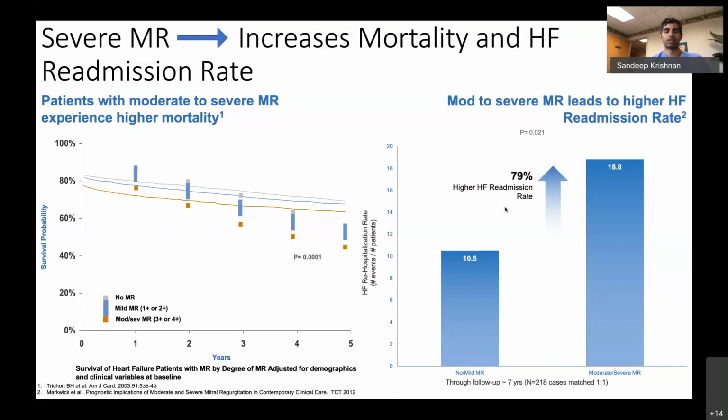Sometimes you can have a very, very severe patient with a very large amount of mitral regurgitation. But the problem is we miss it. Because we miss the jet, we're a little bit off axis, and then it looks like it's maybe mild or moderate. And that may be the only clue that we have that this patient with an EF of 25 to 30% has significant severe functional mitral regurgitation. But what we do know is that these patients who are untreated don't do well. Their 5-year survival, I mean, this rivals cancer. This is why heart failure is such a deadly disease.